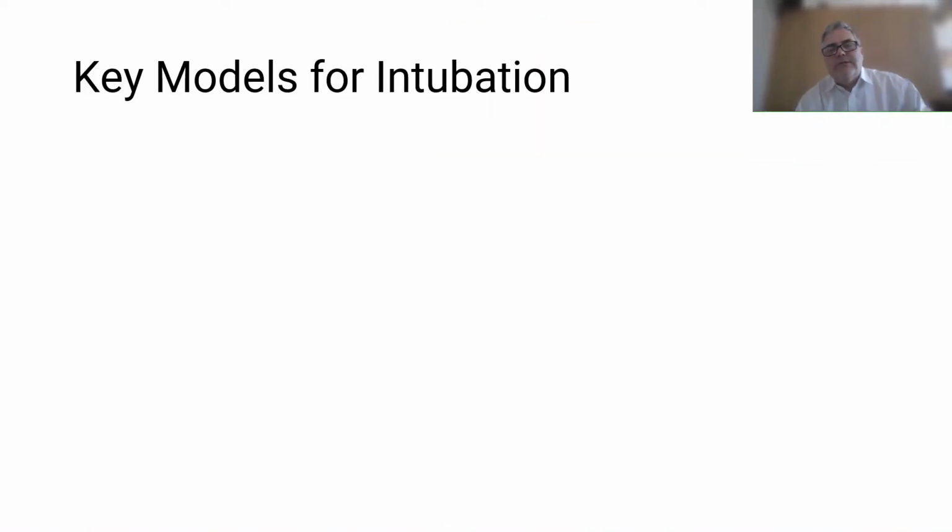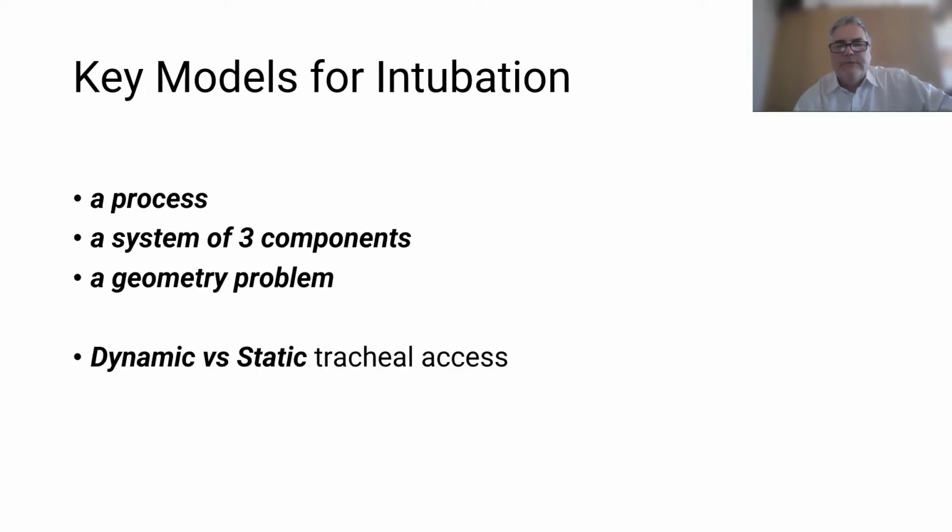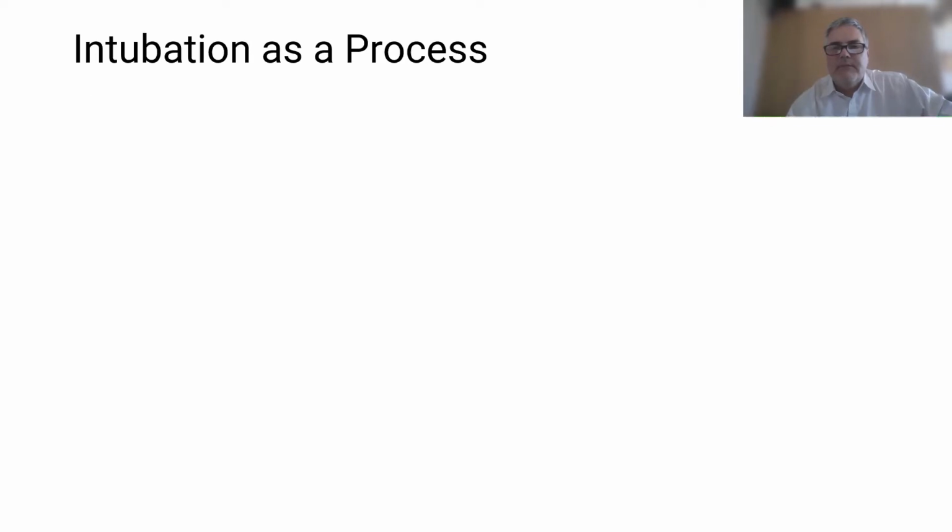Key models for intubation. This is the intubation modeling I use when I teach residents. Intubation is a process, a 2-step process. Intubation is achieved with a system of 3 components. And largely, when I teach intubation, I think of solving geometry problems. And we talk a lot about dynamic versus static tracheal access with video laryngoscopy.